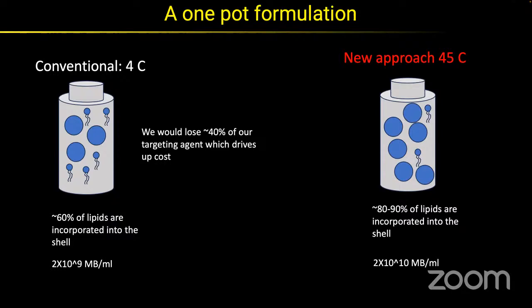So we started working with a collaborator in Taiwan. They have this really interesting approach where they actually heat the lipid solution prior to activation. And this really goes against the current paradigm of doing it cold. However, what it does is it enhances liposome formation and greatly enhances microbubble production. So when we started testing this out, what we saw is that we're actually getting an order of magnitude more microbubbles. Actually, it became a problem for us because we're injecting contrast into mice, and all of a sudden we're dealing with an order of magnitude more.